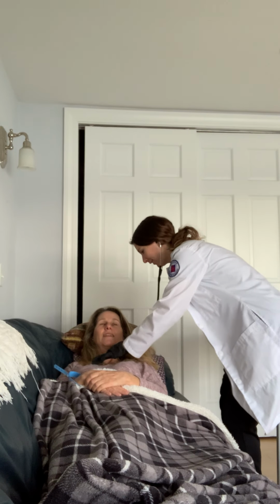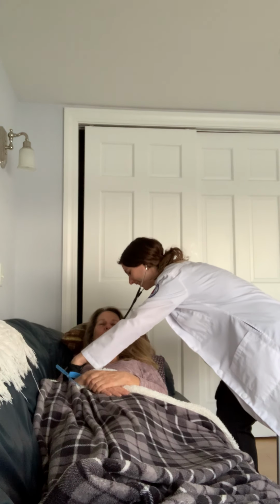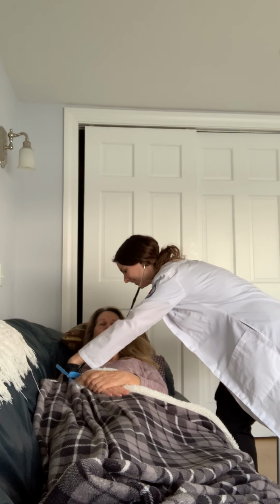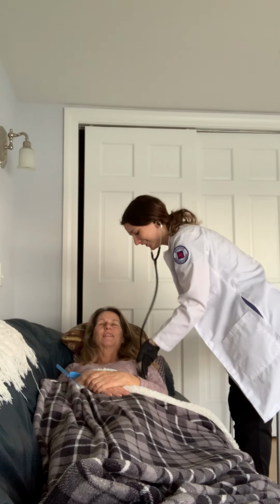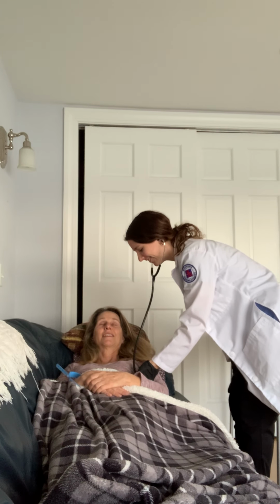Again. One more time. Okay, your breath sounds are nice and clear, indicating to me that there's been no aspiration.